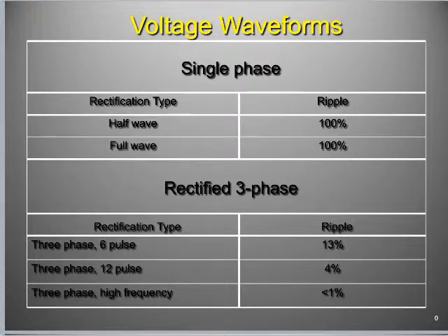So the McDonald's sign, we flipped the negative part over the x-axis, over the 0 line, and now we have 120 pulses per second. 120 pulses per second, 100% ripple. So it means we're getting more x-rays, right? But they have varying amounts of energy.